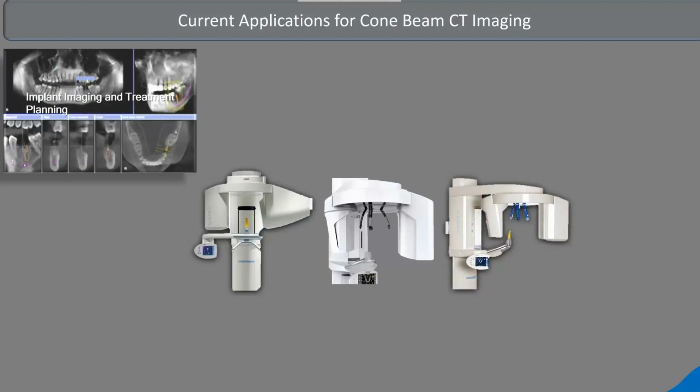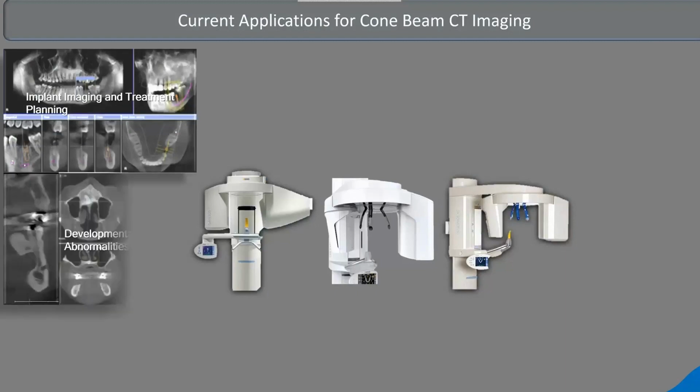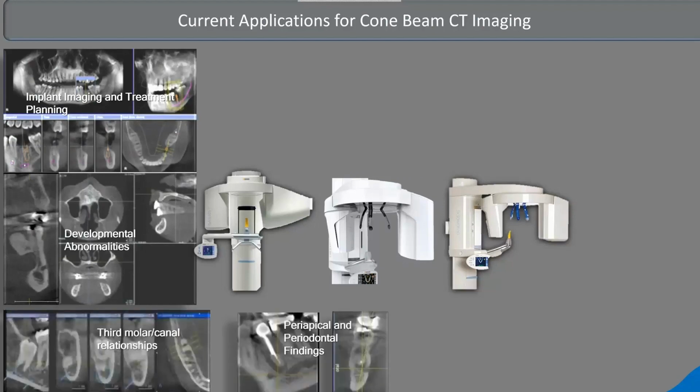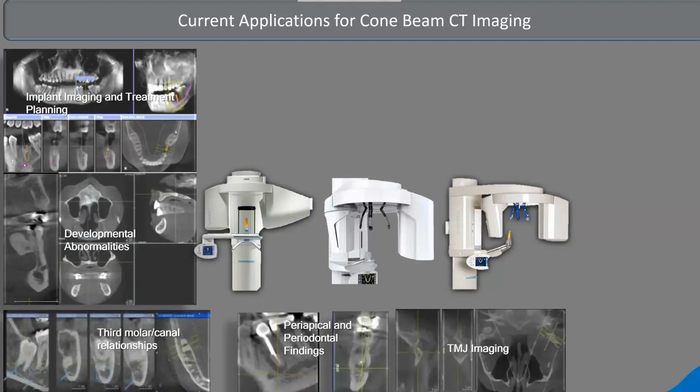And we're seeing all of this technology come into dentistry as a result of needing a low dose three-dimensional imaging for our implant treatment planning.